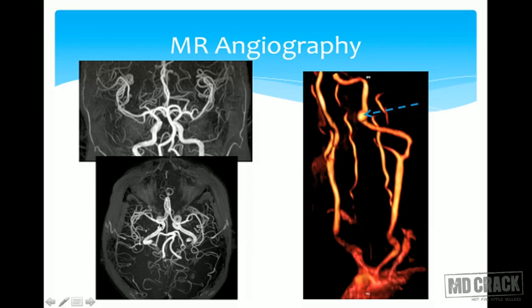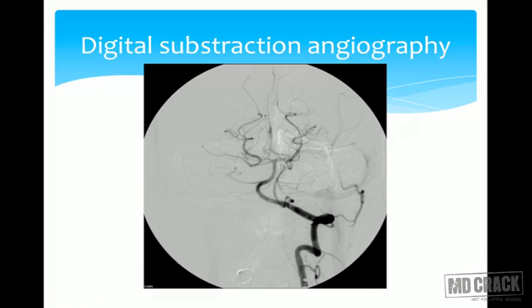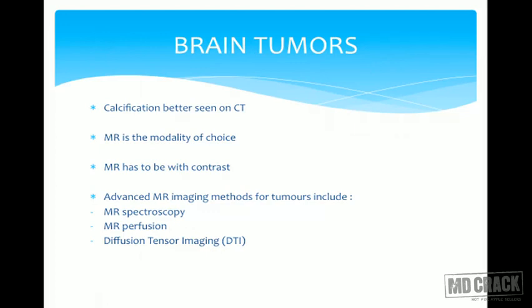MR angiography images of the intracranial vessels — vertebral arteries, basilar artery, ICA, MCA, and anterior cerebral arteries — can be obtained without contrast injection. In one patient, MR angiography of the neck vessels revealed a small fusiform, non-thrombosed aneurysm. Again, digital subtraction angiography remains the modality of choice for final evaluation of AVMs and aneurysms.